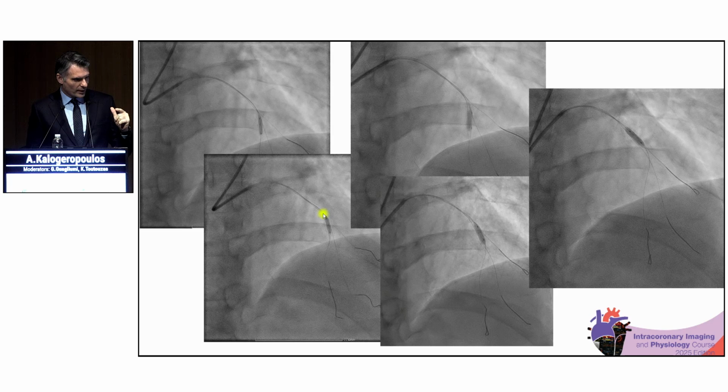Then we used a Scoreflex 3.0 in the mid-segment here. The actual vessel diameter was 3.5. And then for the more proximal lesion, which was quite fibrotic, we used a cutting Wolverine 3.5 millimeters. Again, I'm going to high pressures there as well, 16, 18 atmospheres, even though it's a semi-compliant balloon.